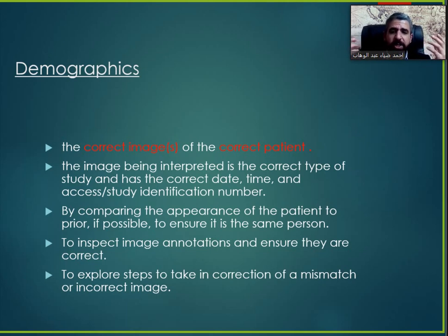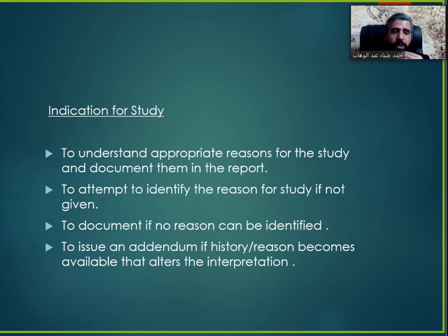We inspect the image annotations and ensure they are correct, whether it's with contrast, without contrast, and things like that. They should also help to explore steps to take in case of correction of a mismatch or incorrect image. If this was an incorrect image, not the same patient, why did this happen? How can we help prevent these things in the future?